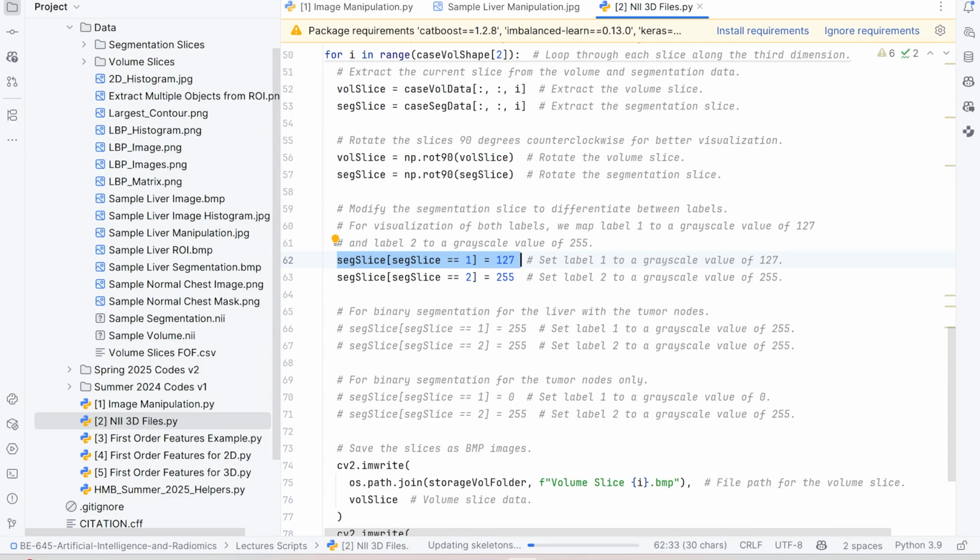And to distinguish between each of them, they gave each of them different values or labels. They gave the whole organ a label of 1 and the tumor a label of 2. And of course, the background is 0. So now we have 2 labels. And for sure, not all of the datasets is like that. It depends on who is segmenting and the way they are segmenting the images. Simply, you can find images and masks with 3 labels, 4 labels, and so on.